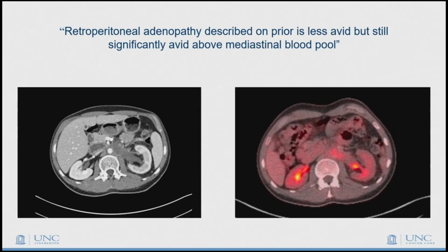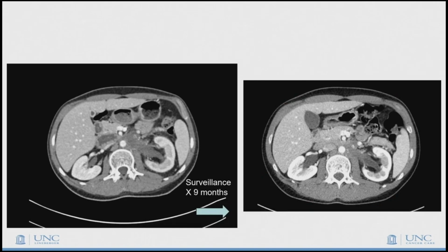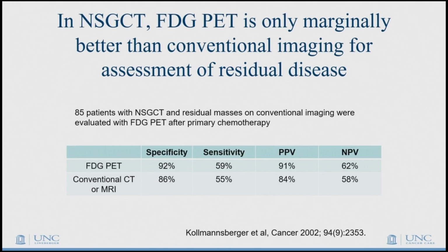And I've really learned over time, unless they say that's a blaring hot, definitely tumor, I watch these patients now. And I watched this patient, and he's still doing great. These are scans later. So in non-seminoma, that's similar to the staging data.